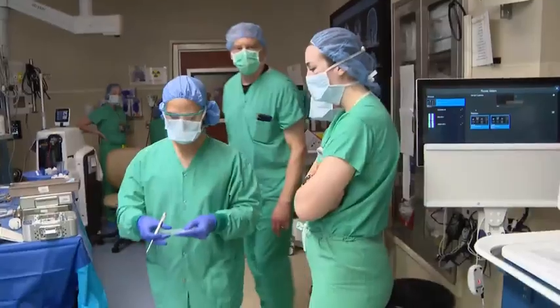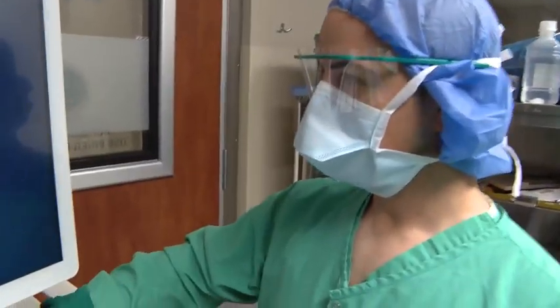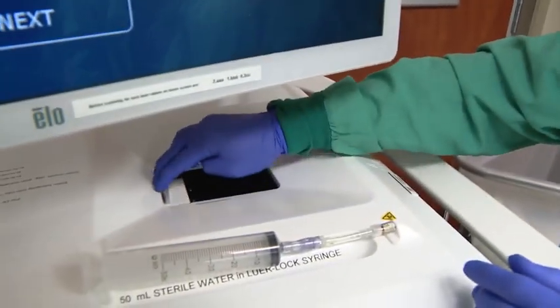However, we're going to be using a new modality of an imaging system that's going to give us an immediate picture within 4 minutes that is artificial intelligence generated with no staining of the tissue, but a digital stain. Just steps from the operating table, the tumor samples are loaded into a machine ready to process on the spot.